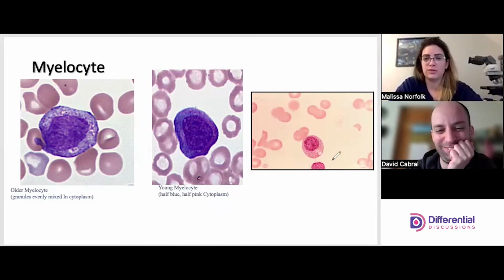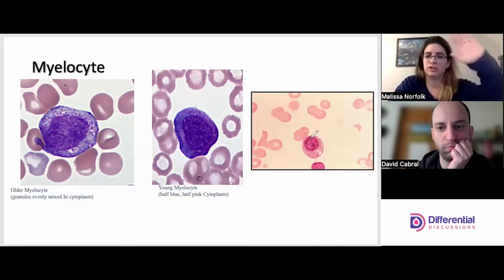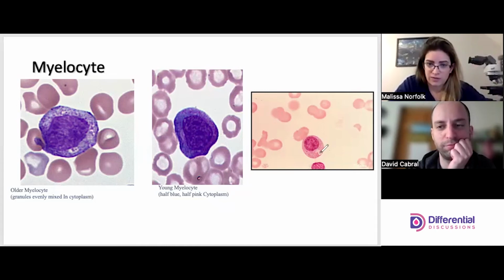Okay, and then over here we just have another example of a myelocyte. Nice round, eccentrically offset to the side. These are round in the center-ish, but you can tell this is eccentrically placed, where the changes are happening. This is where the Golgi apparatus is, right? This is that little flat edge. The flat edge is a little bit smaller on this one. And you have a Golgi apparatus here. There's also a vacuole right there, but the Golgi apparatus is right here.